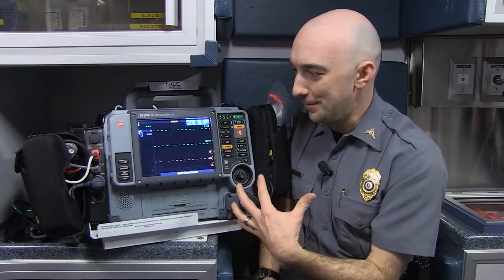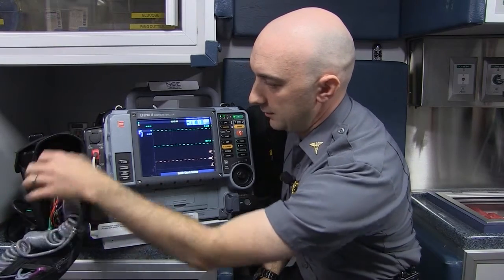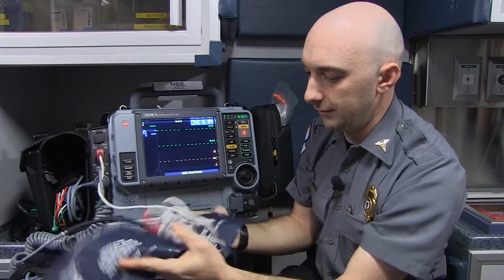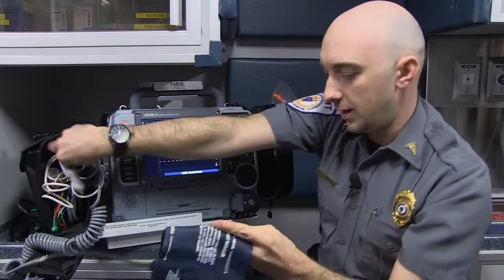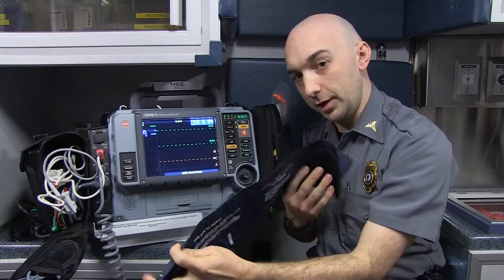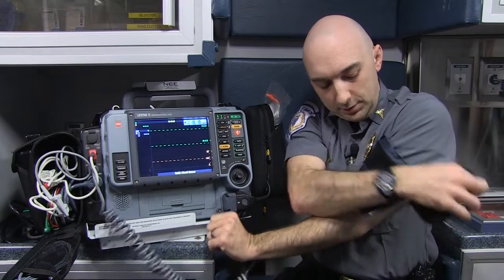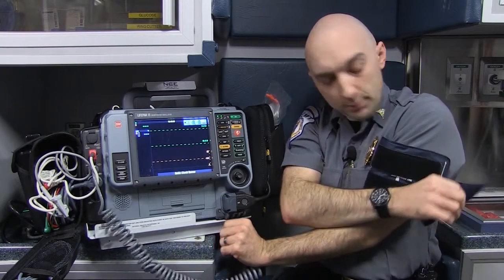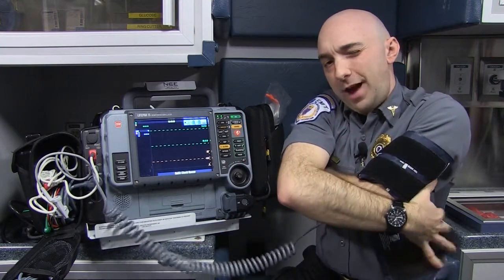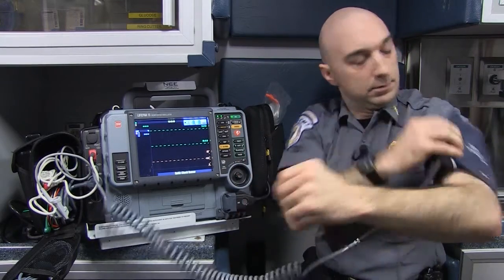We'll start off by hooking me up and go from basic to complex. This is just your standard blood pressure cuff that you would have at the doctor's office, and this machine can actually take a blood pressure for us. We can set it to take blood pressures at regular intervals — whatever we want — so this allows us to monitor a patient's blood pressure in real time while they're on the ambulance and get a sense of how their vital signs are changing as we're treating them.